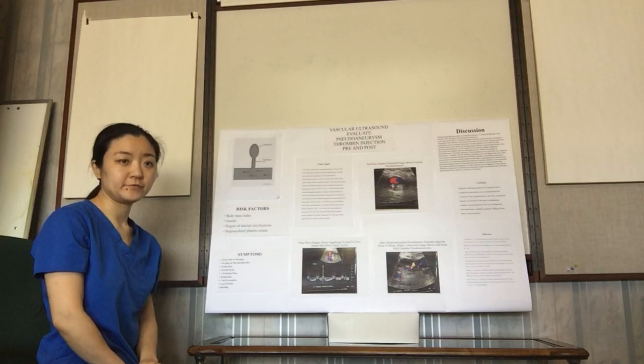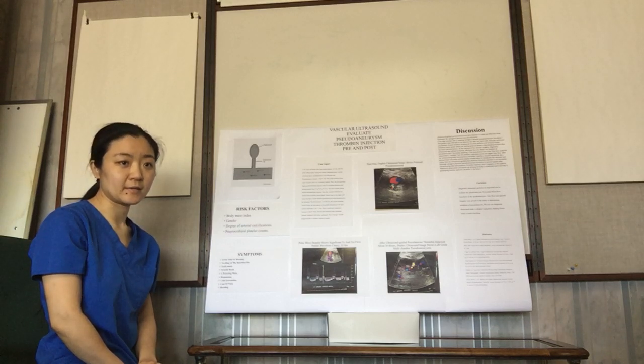Generally speaking, if a pseudoaneurysm is less than 3 centimeters, we only need to observe it. But in this patient, the pseudoaneurysms are bigger than 3 centimeters. Although femoral pseudoaneurysm formation is rare after ultrasound-guided thrombin injection, it happened in this patient. Additional observation and a follow-up ultrasound study is scheduled and will help monitor the patient's situation in the future.